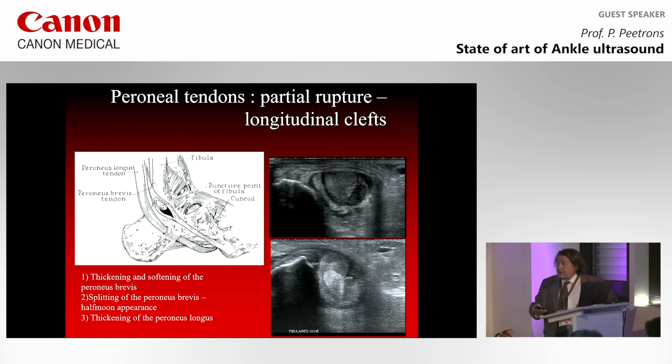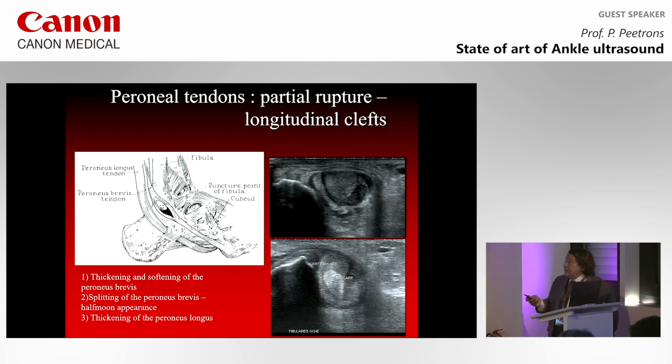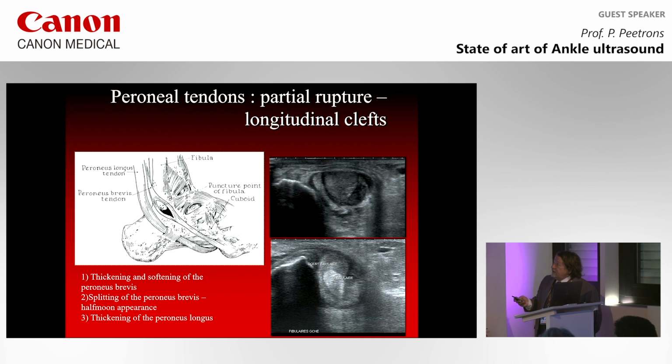This is what happens when you have a peroneus brevis lesion. Don't forget this image. This is a very important image because in this case you see that the peroneus longus tendon is much bigger than the peroneus brevis. You have to describe this is abnormally thick, but this is also abnormal. This is abnormally thin. The peroneus longus is going inside the peroneus brevis, like in this image.